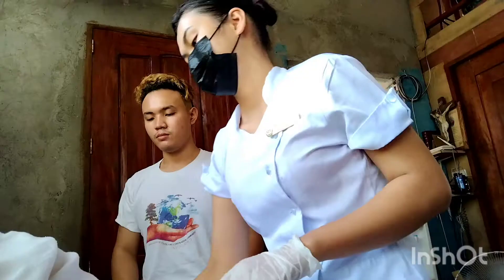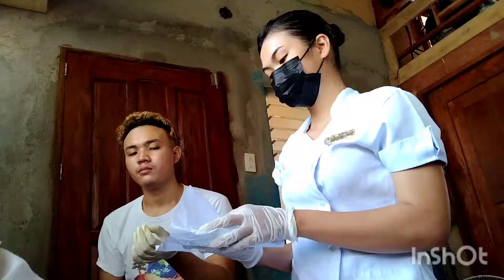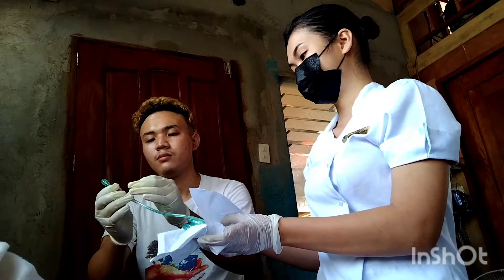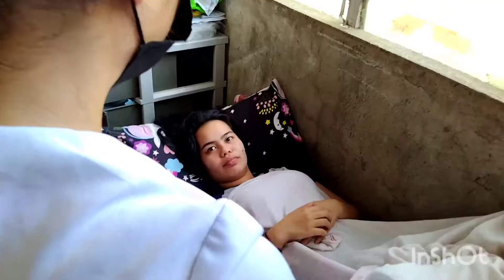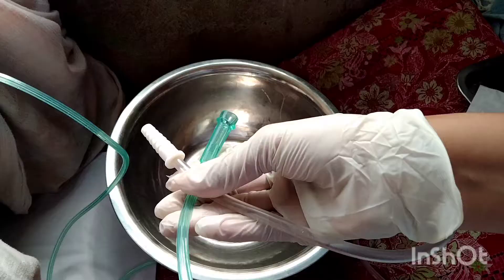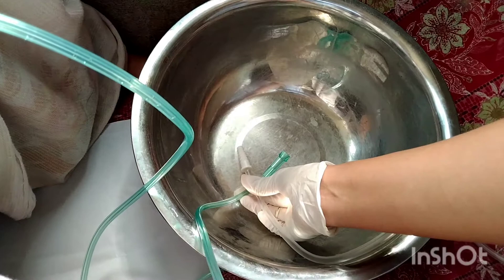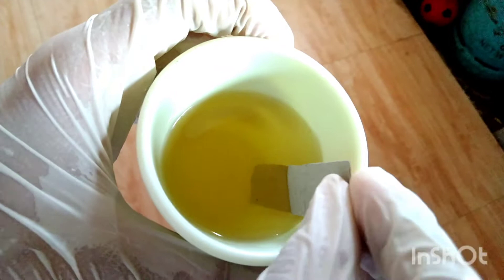Place an adequate amount of lubricant over the non-dominant hand after the doctor cleanses the urinary meatus. Pick the Foley catheter size according to age, and remove the outside pack observing sterility, ensuring the tip of the catheter will be offered for lubrication and insertion. The outside pack is unsterile; the doctor will pick the tip of the catheter for lubrication. Instruct the client to breathe through the mouth while the doctor inserts the catheter to the urinary meatus, as relaxation of the external sphincter aids insertion. Collect urine specimen if needed by holding the end of the catheter over the specimen bottle. This allows a sterile specimen to be obtained for culture analysis.